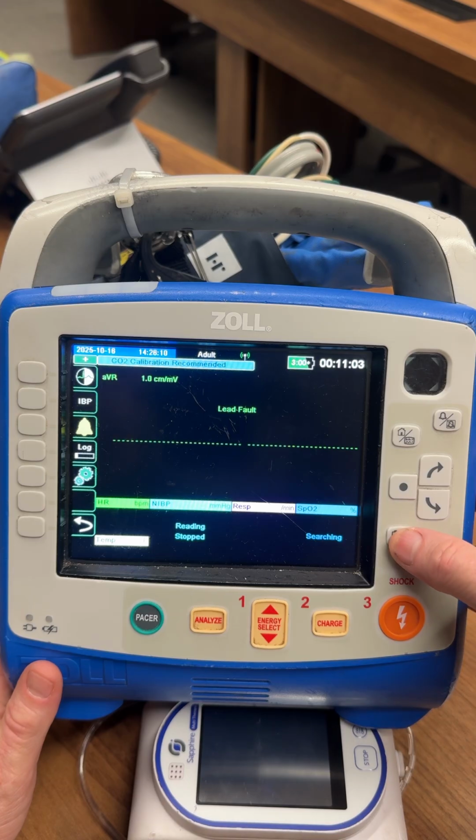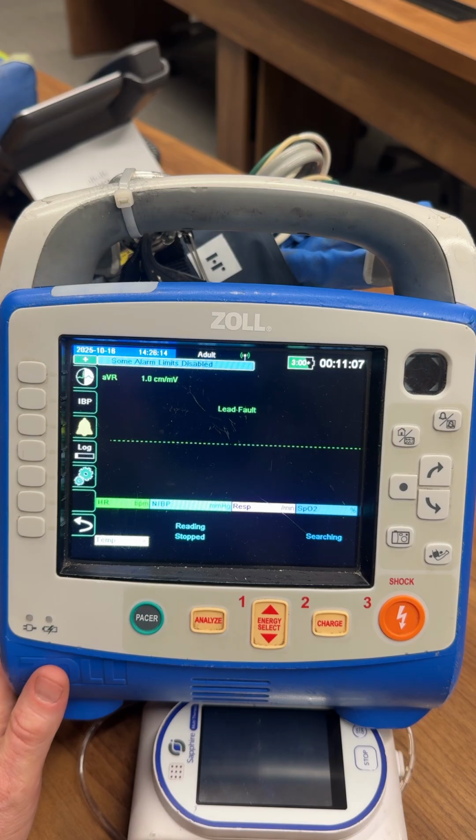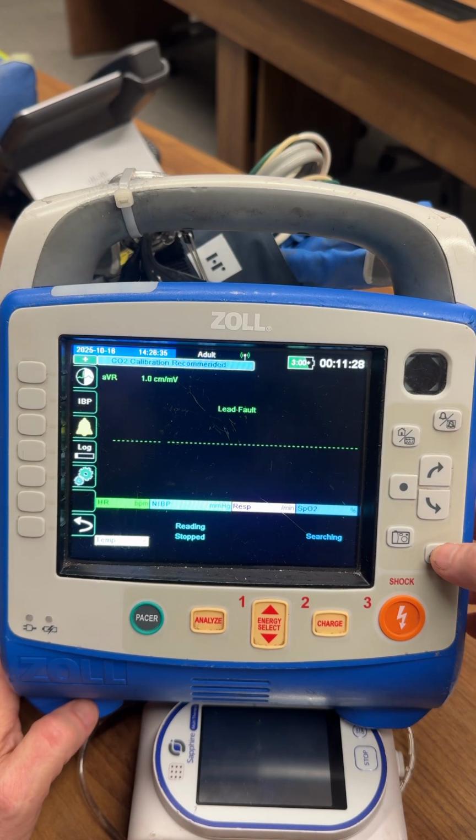This is a snapshot button right here. It looks like a little camera. If you have a patient that just went into a different rhythm and you want to catch it, you can hit that snapshot button. It'll back up and record for some time frame prior. A lot of times I do it when I'm turning over into the ER. I will hit that snapshot button in order to catch a current EtCO2 waveform, if your patient is intubated. You've got your manual blood pressure cuff right here.